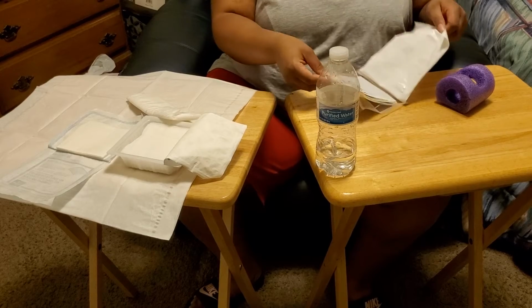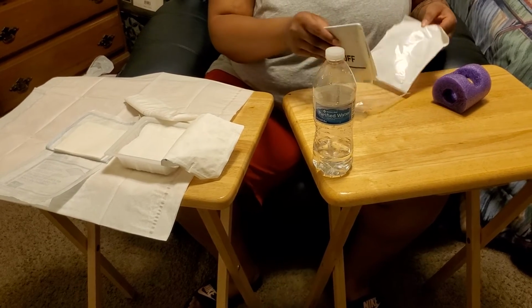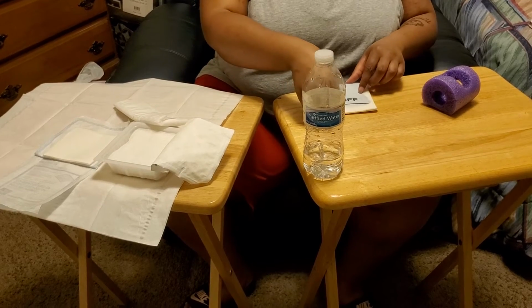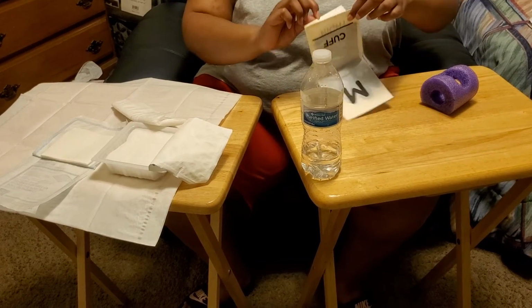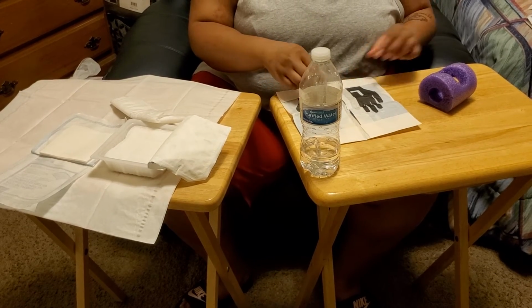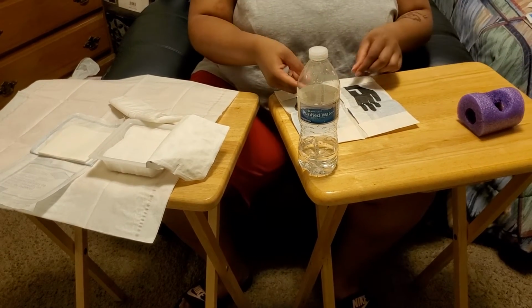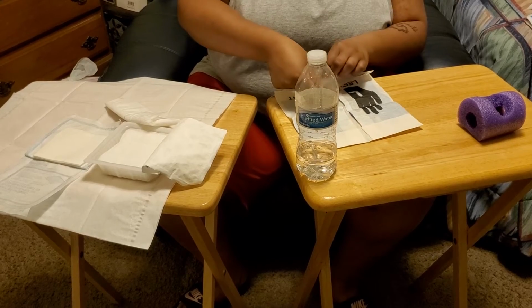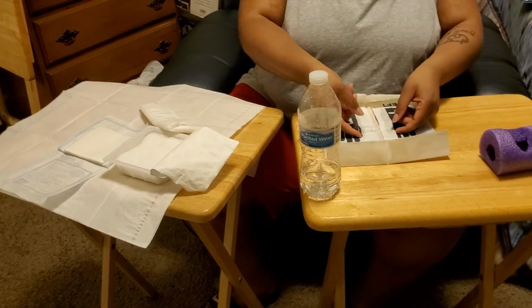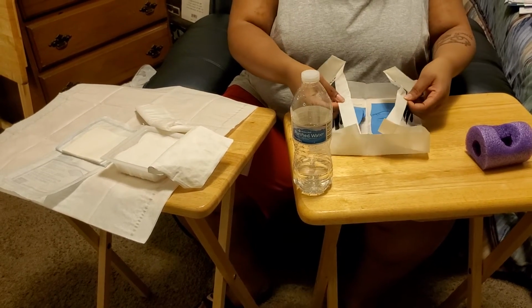So I would open it like so. Use the fingertips to open.